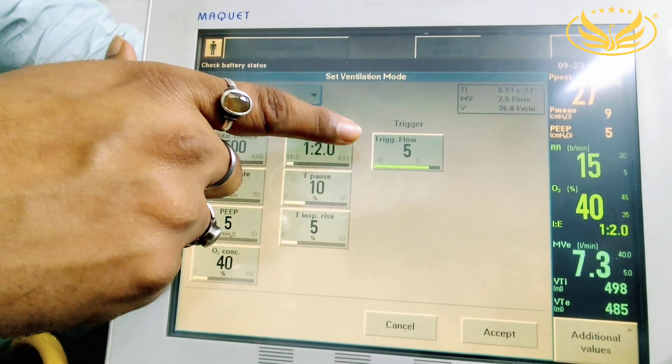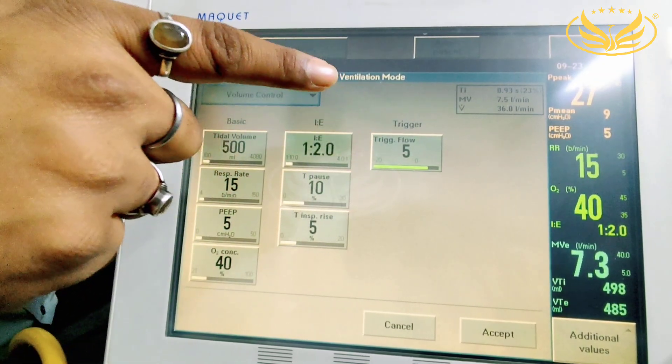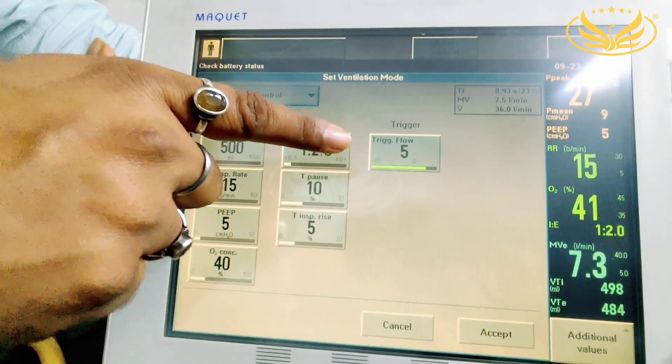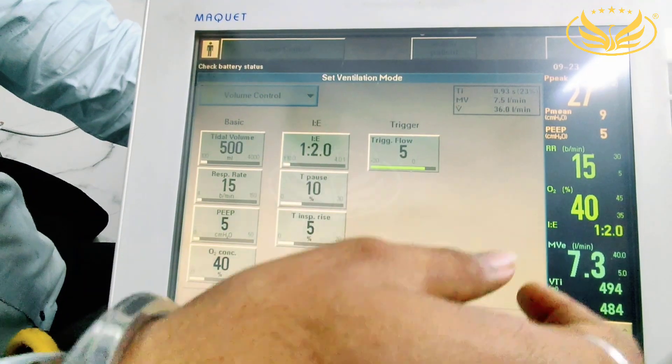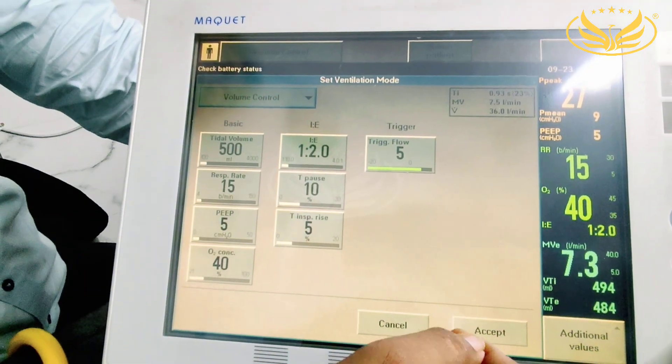The trigger is something that acts according to the response of the patient.